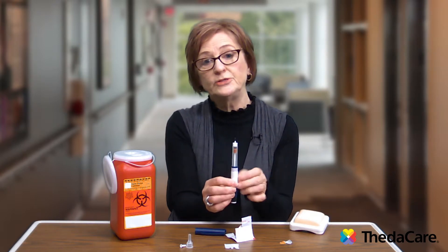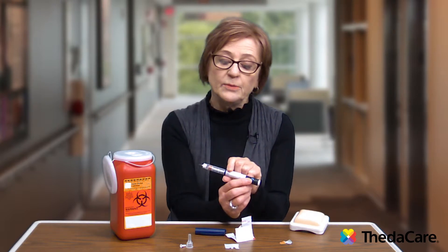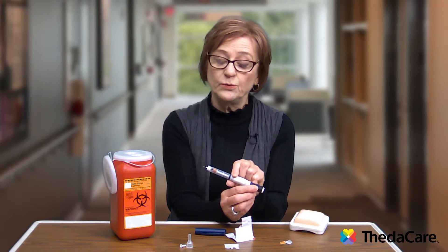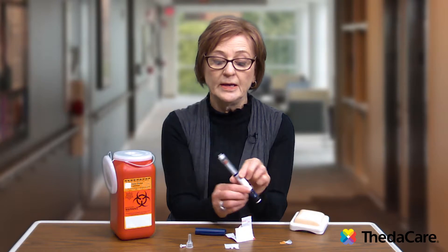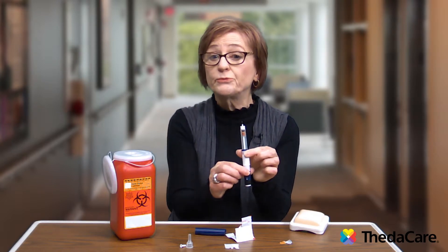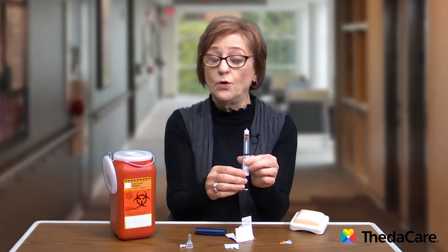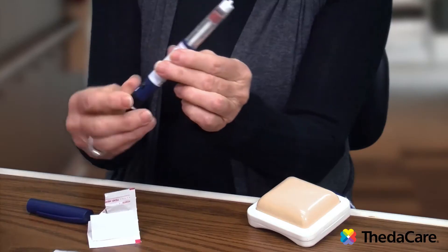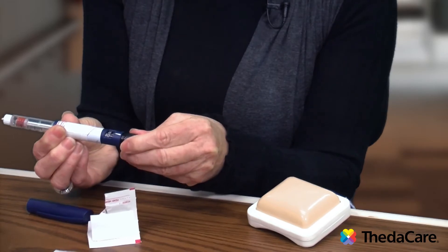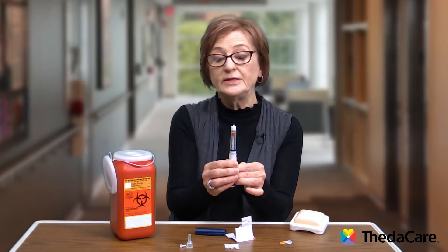Now you're ready to dial up the dose of insulin that you are to take. We're going to practice with 15 units — check with your doctor on how much you are to start with. Know that a cartridge usually has about 300 units in it, so it can be used over and over until it's empty. So we're going to dial this up to 15, and then you're ready to give your injection.